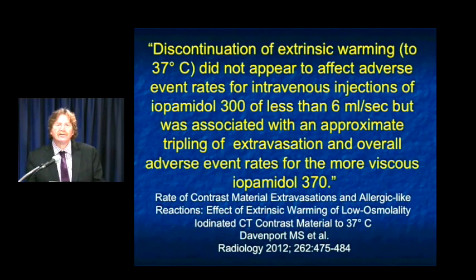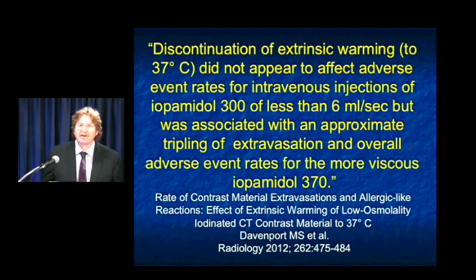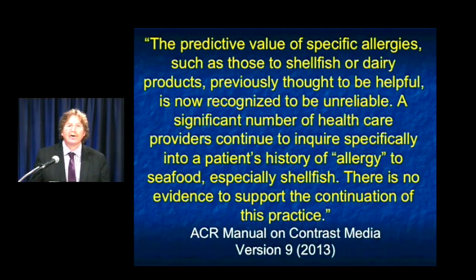Now, it's interesting, there have been several articles that show that for faster injection rates, warming the contrast becomes important. In this article from Duke, tripling of extravasation and overall adverse events occurred when you did not warm the contrast material. So that is alone a great reason for warming contrast material. Less reactions, less controversy, less extravasations, less problems. So our thing is get a warmer, use it, monitor it. It's great for patient safety.